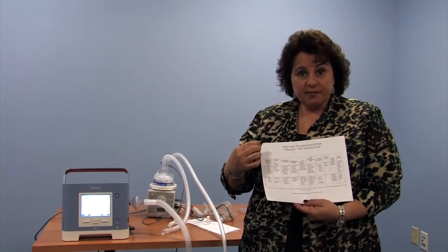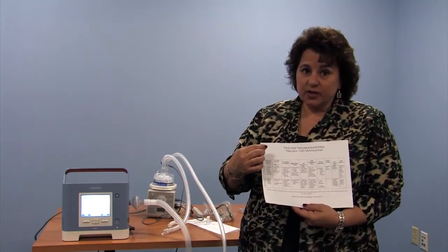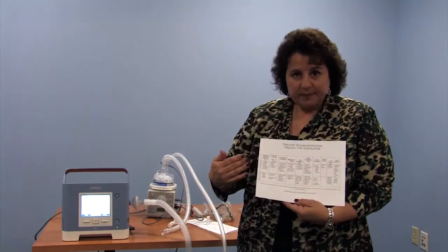Once you're more familiar with the machine, if you feel comfortable with some of the numbers that you see there, alarms can be set, such as low respiratory rate, high respiratory rate. The machine also alarms for minute volume. We talked about minute volume being how many breaths your child takes and the size of them, and the machine's looking at that number constantly. The oximeter is also an alarm for you for the safety of your child, looking at heart rate and oxygen saturation, so that you can use these to help.